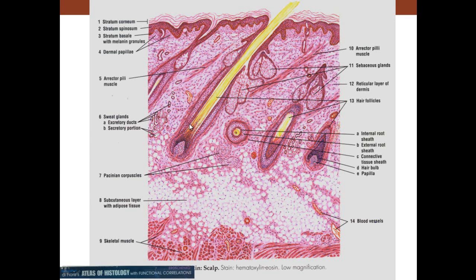In thin skin, we can see hair follicles. Hair follicles project up through there. This is a smooth muscle here, an arrector pili muscle that pulls the hair up. If you've ever seen a cat that's upset, the hair is sticking up; their arrector pili muscle is pulling the hair up. Also, the hair is pulled up when you're cold, and as a consequence, the surface of the epidermis makes a little indentation. We call that chill bumps or cold bumps, which is really the effort of the skin to pull the hair up to warm.